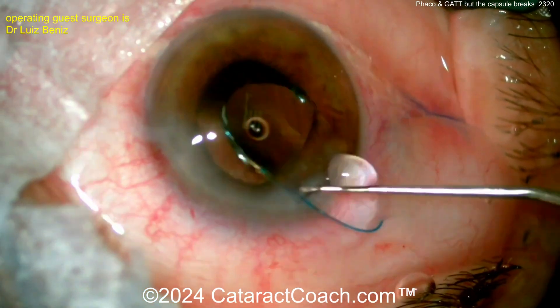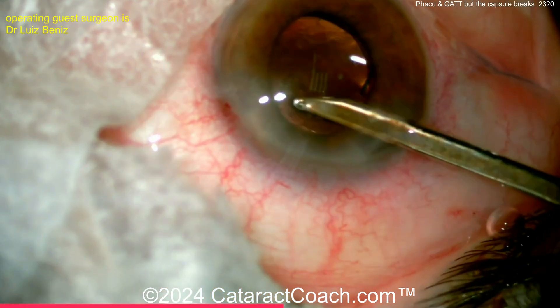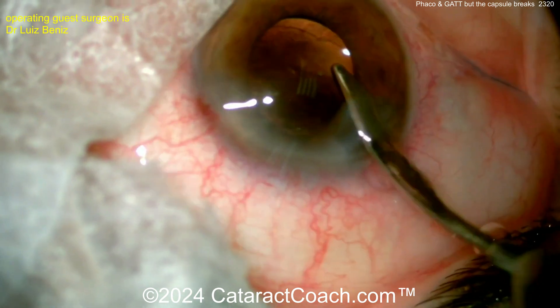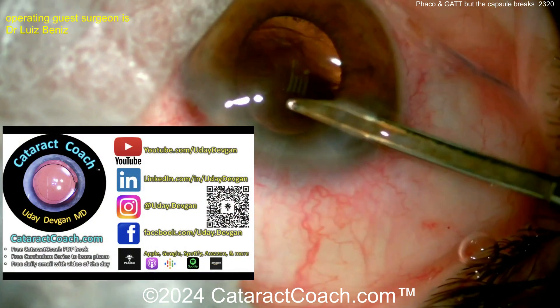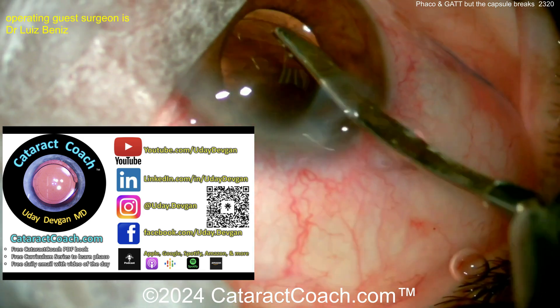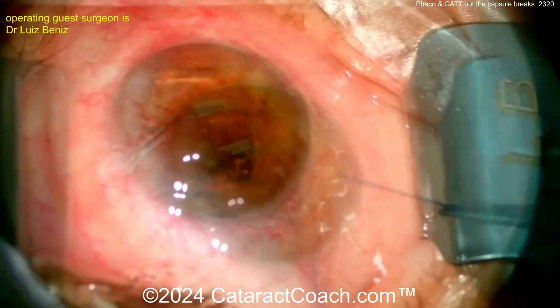There comes the three-piece lens being put in the eye appropriately, getting that dialed in. I believe the whole lens is in the capsule bag — I do like that result. Take out the viscoelastic slowly and gently. By the way, the Cataract Coach website has so much great material — so much to learn, much better than YouTube. There's a free PDF book available. If you are a resident and I meet you in person, my first question is: have you downloaded the free book?